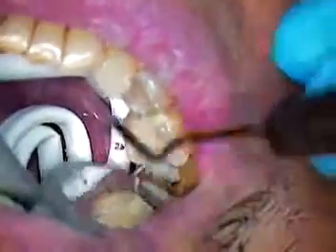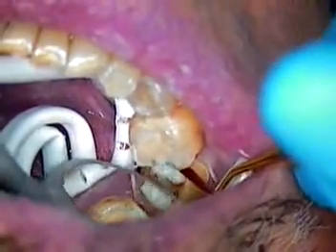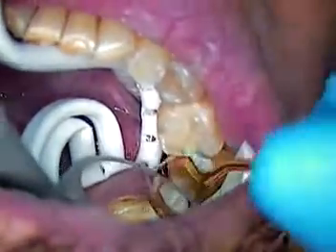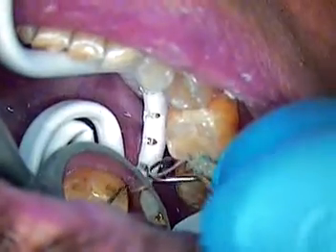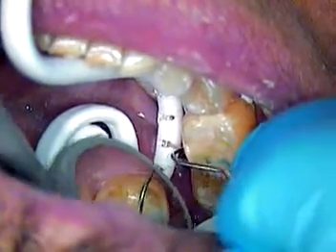We may toggle back and forth — I might use an explorer. The key is to stay underneath; don't create a trough in the soft tissue. Using smaller instruments sometimes to get around angles is important.